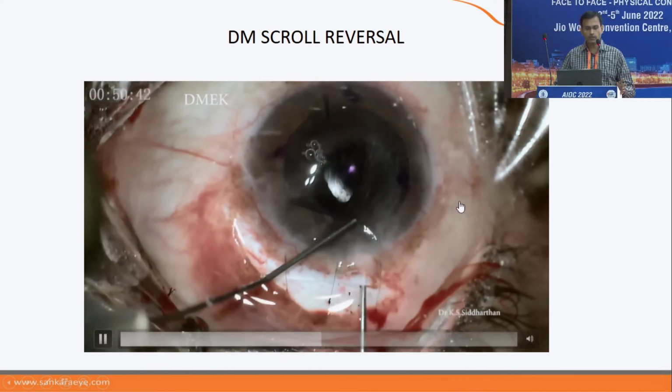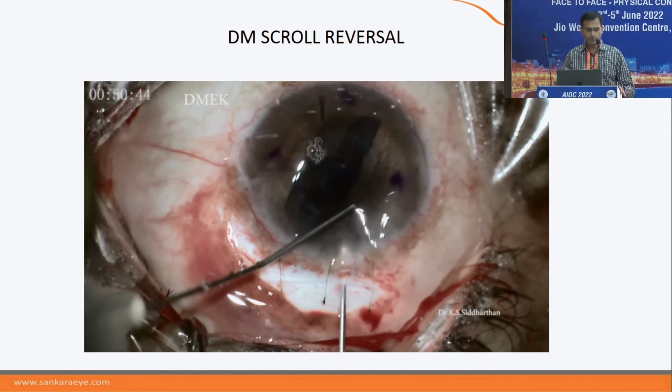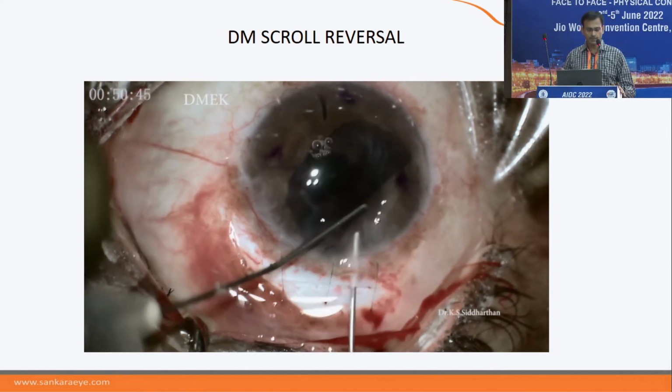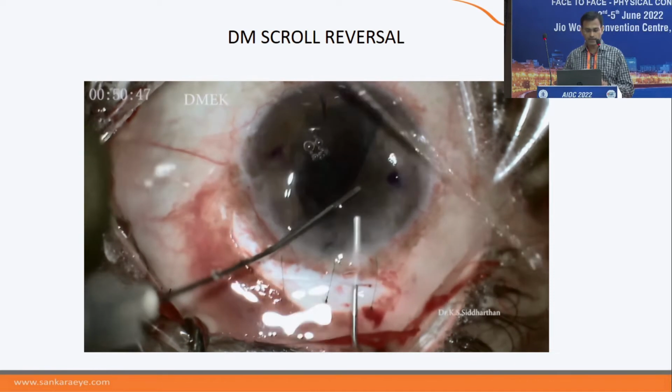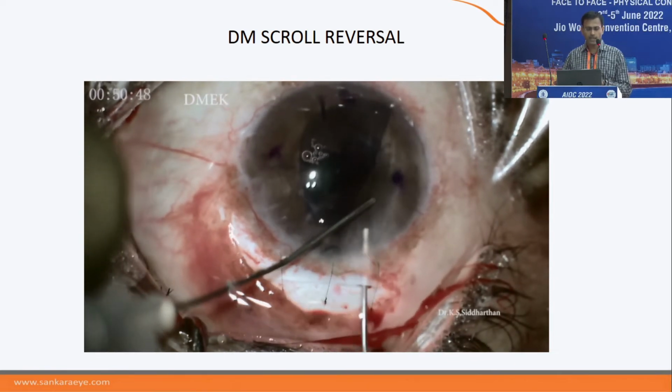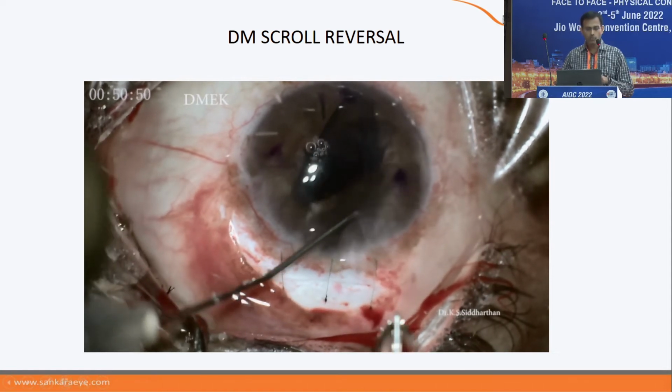So here, how do you reverse it? Hold with your left hand. I'm injecting the saline under. You see the tissue, the fluid is going under. With the left hand, I'm making sure that the fold is staying, and with the right hand, I'm injecting saline, and keep looking at the inner flap. You see how the flap came out? So that's how you have to reverse it.